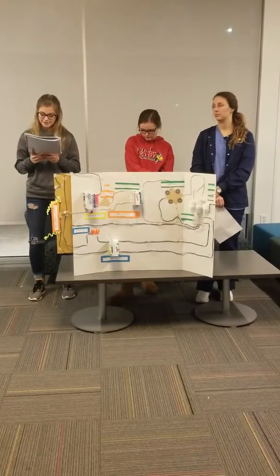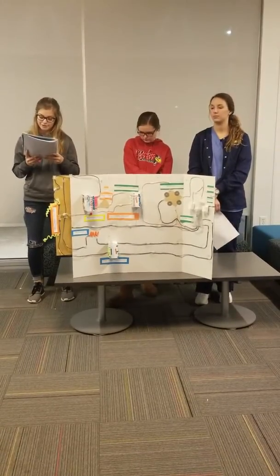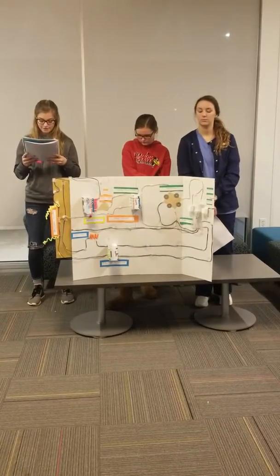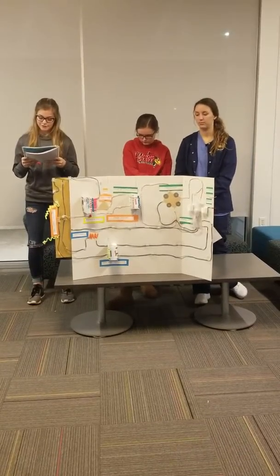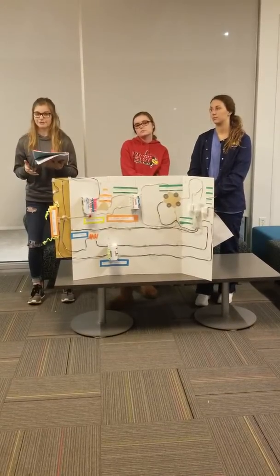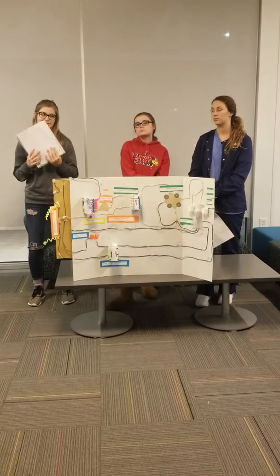In the primary circuit, a voltage is determined by the auto transformer and applied to the primary side of the step-up transformer. A voltage is then selected from the auto transformer and applied to the filament circuit. And then the stage is set for the rest of the circuit, which is the secondary.